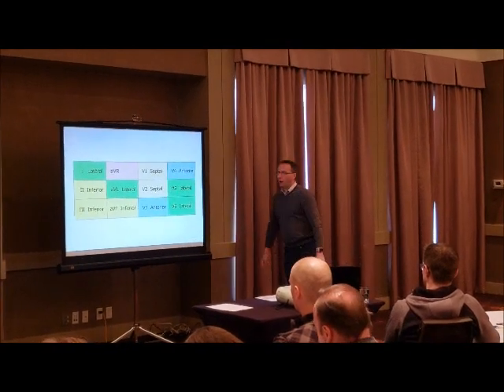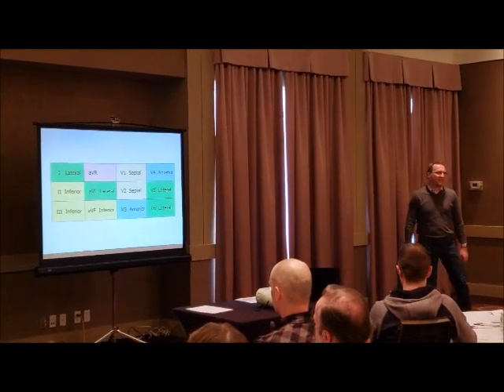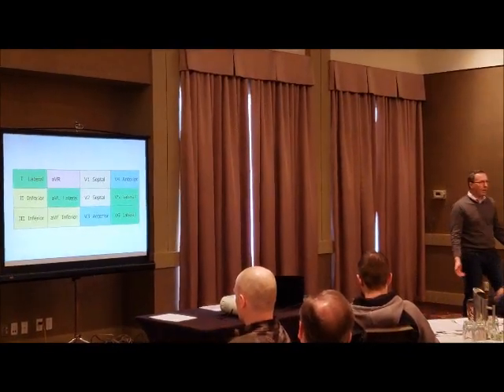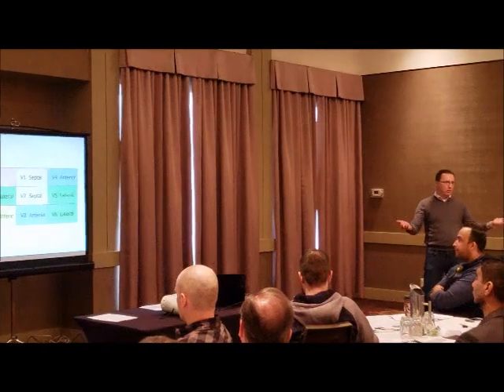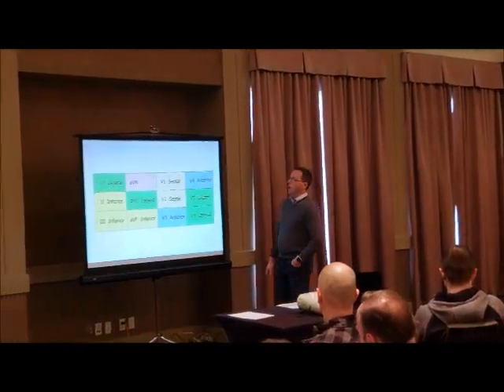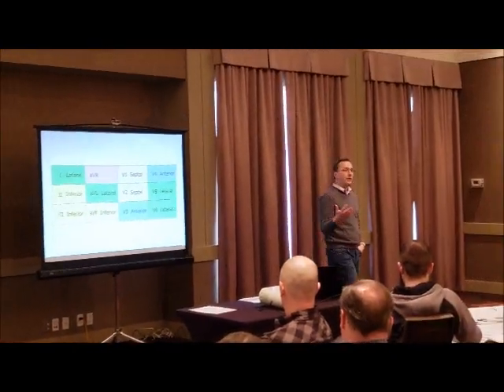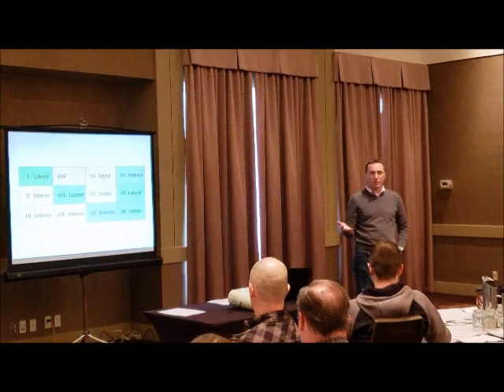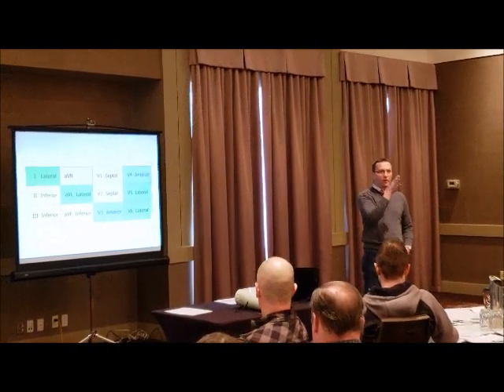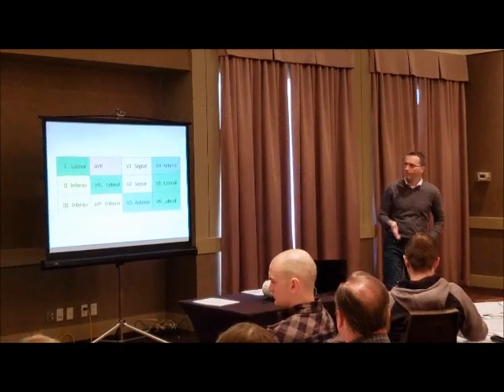So here's the chart that shows the anatomically contiguous leads. Again, leads V1 and V2, although they say septal, you might as well just throw them in with V3 and V4, because those are the leads that show ST elevation with LAD occlusion. Usually, sometimes more so-called extensive infarct, but let's start over here. Very simple. Inferior leads take up the lower left-hand corner of the 12-lead ECG paper. So 2, 3, and AVF make up the lower left-hand corner of the ECG paper. Those are the inferior leads, okay?